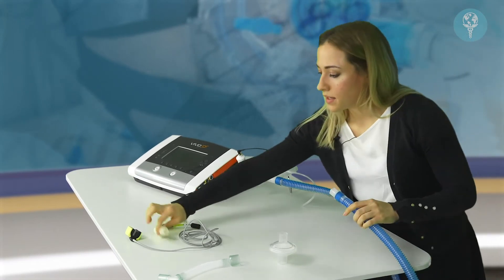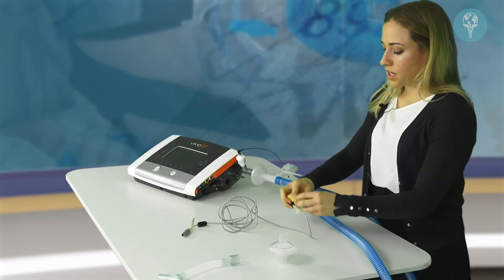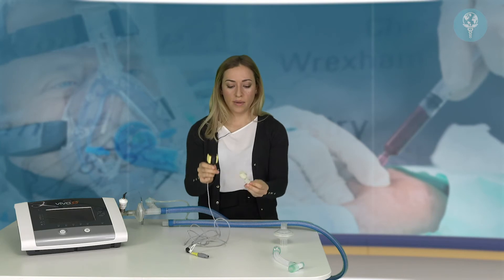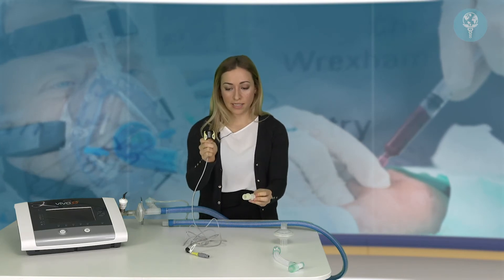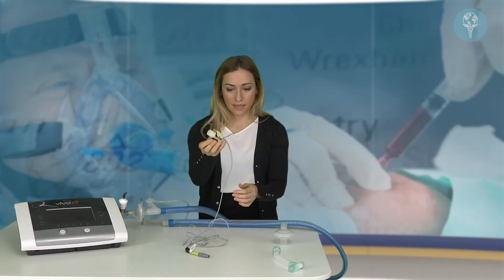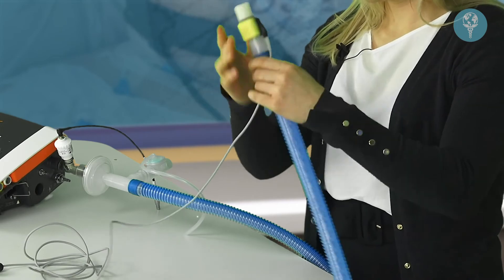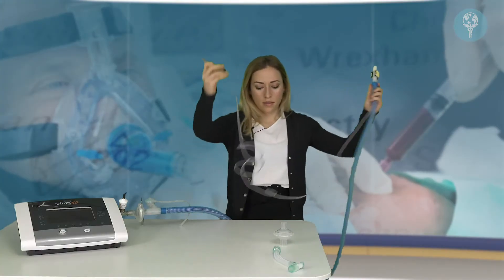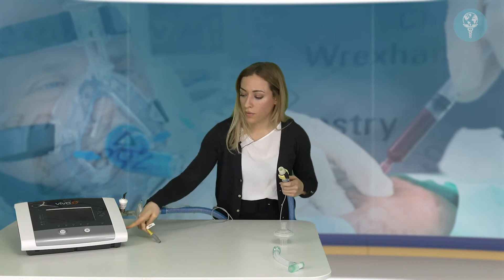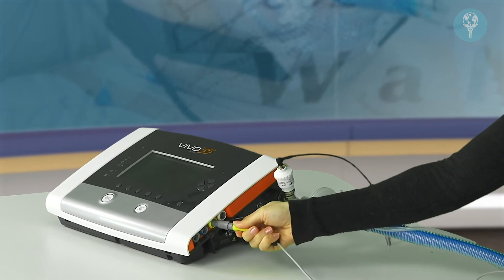Then we have the end tidal CO2 connection. It comes in two different parts — the airway adapter as well as the sensor itself, and these two just click together. The sensor sits in the patient circuit. This end of the circuit connects into the yellow port on the side of the ventilator — that's the yellow connection.